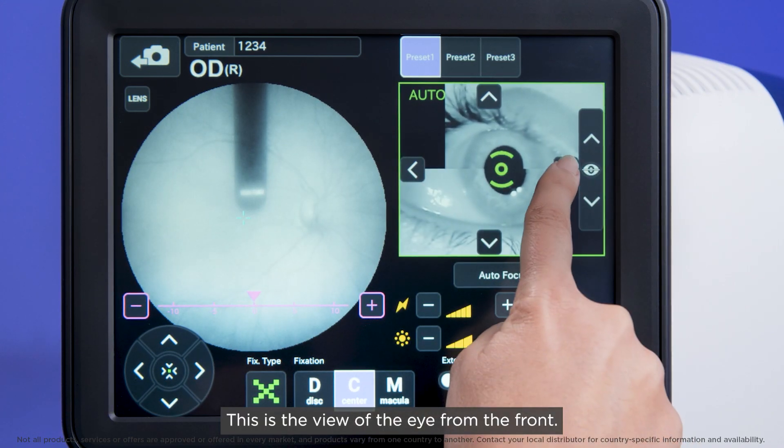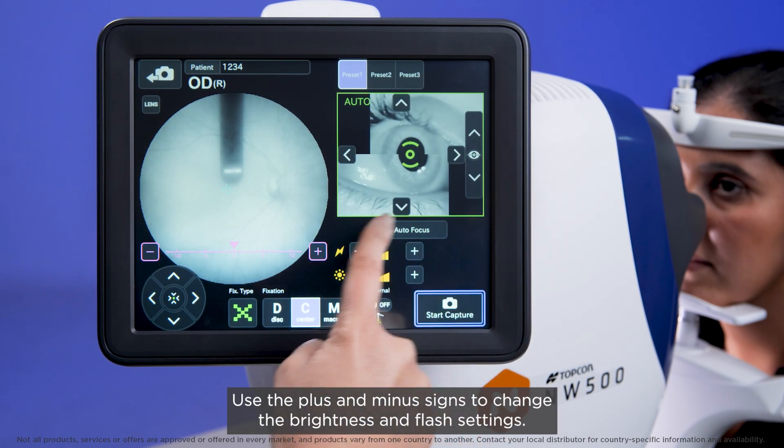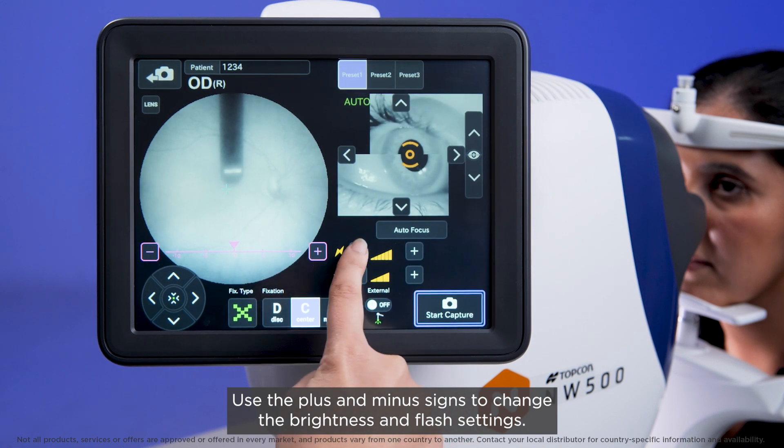This is the view of the eye from the front. Use these arrows to optimise the alignment of the eye. Use the plus and minus signs to change the brightness and flash settings.